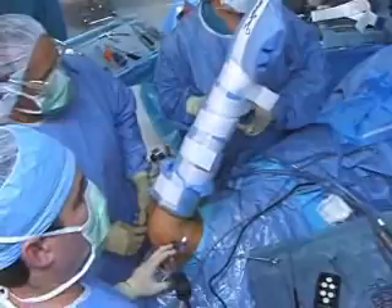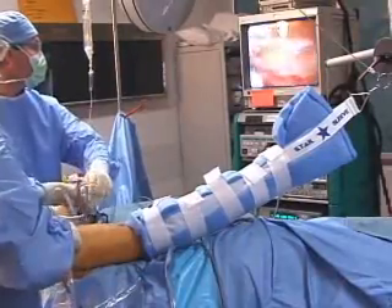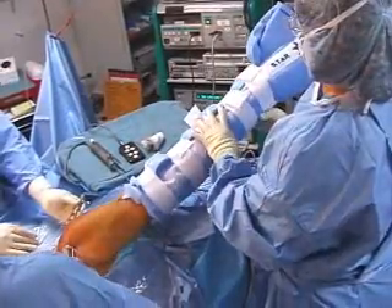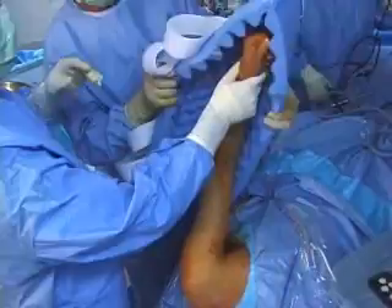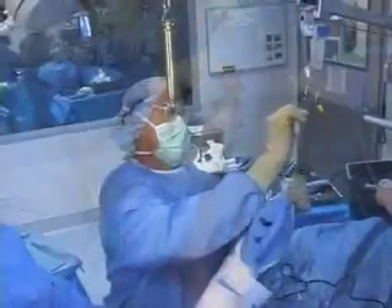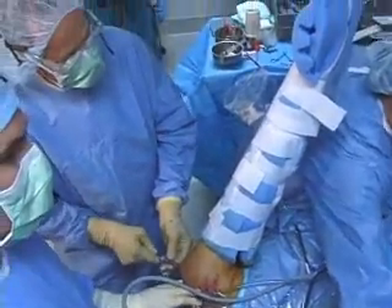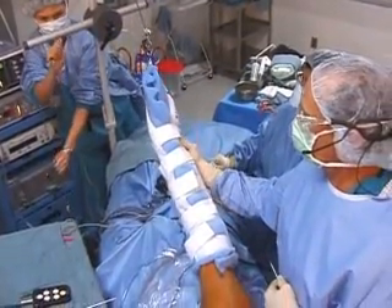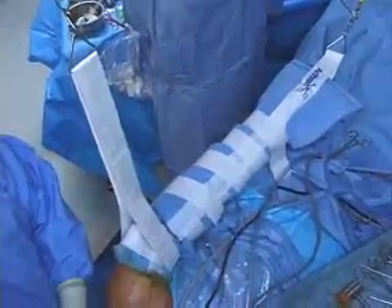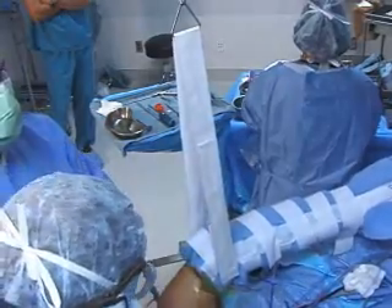The techniques for performing arthroscopic shoulder procedures efficiently are highly dependent on how the surgeon manages the position and distraction of the upper extremity. Recent changes to the Arthrex shoulder distraction system and Star Sleeve have given the shoulder arthroscopist the ability to position the shoulder quickly and efficiently. The three-point shoulder distraction system and Star Sleeve is designed to supply distal traction along with abduction angle adjustability, while also supplying humeral rotation and the capacity to quickly adjust and maintain that rotation without the help of an assistant.